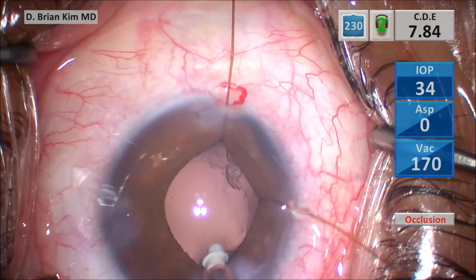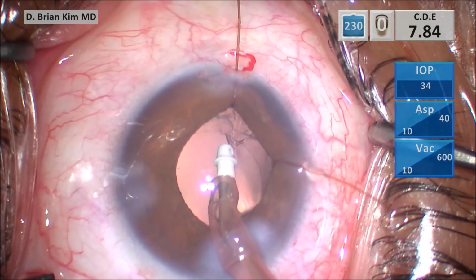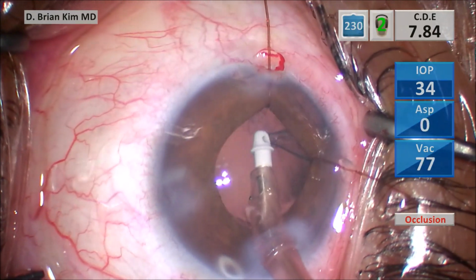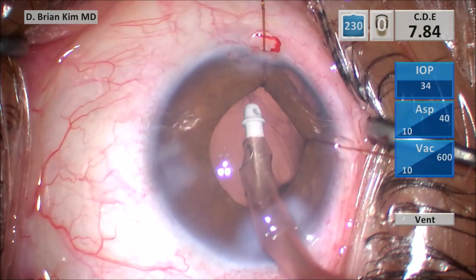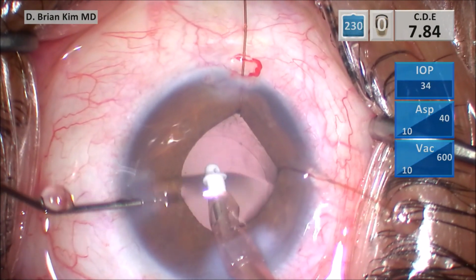But you see, when I go to the area of iridodialysis, as soon as I start to try to remove that cortical material, you can see the capsular bag began to collapse. And it's collapsing. Why? Because there's no opposing force from the zonules in the area of the iridodialysis. All of this kind of makes sense. And all of this makes perfect sense in the context of the trauma.